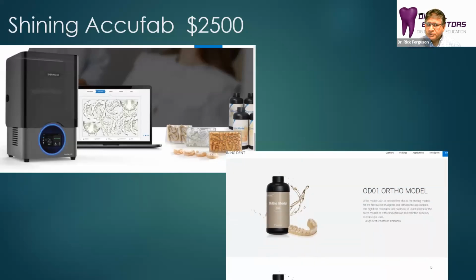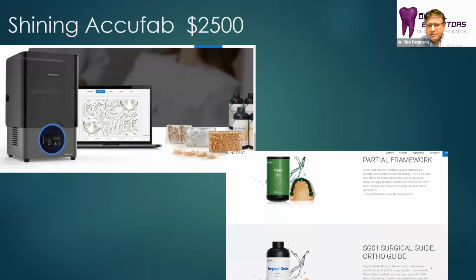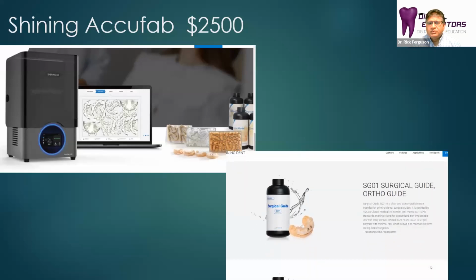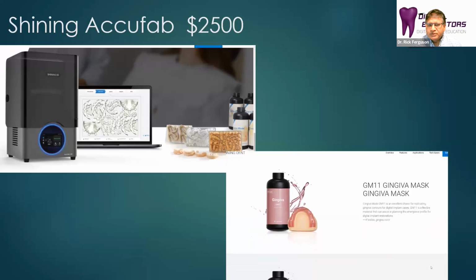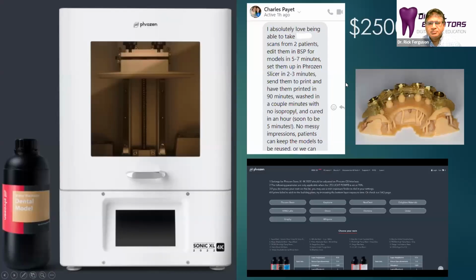It also has pretty robust software, whereas the SprintRay and the Formlabs, for example, will have more robust software that you can create models and such with directly from intraoral scans. That's actually also built into the software for this particular printer.